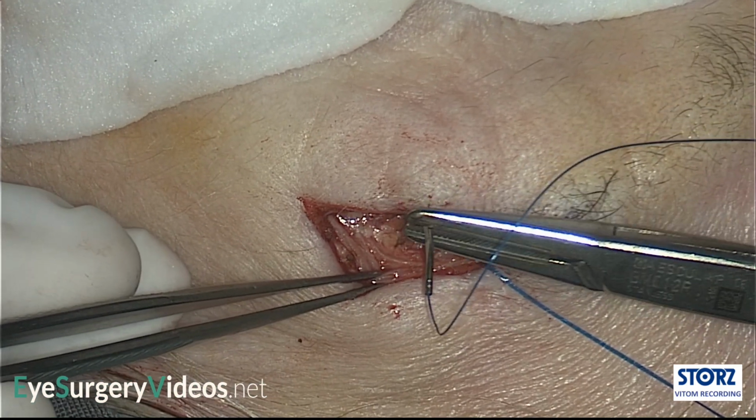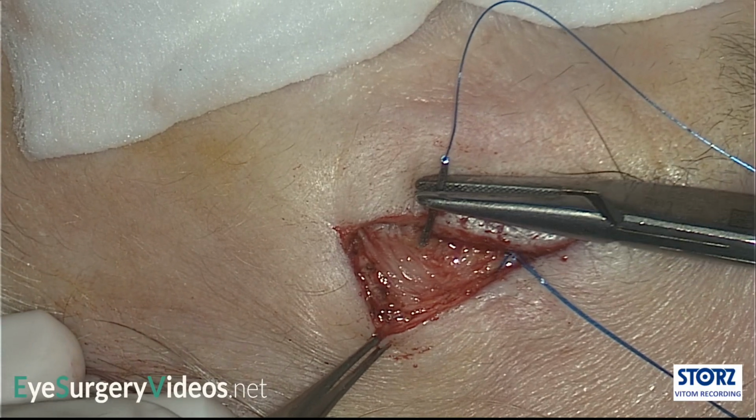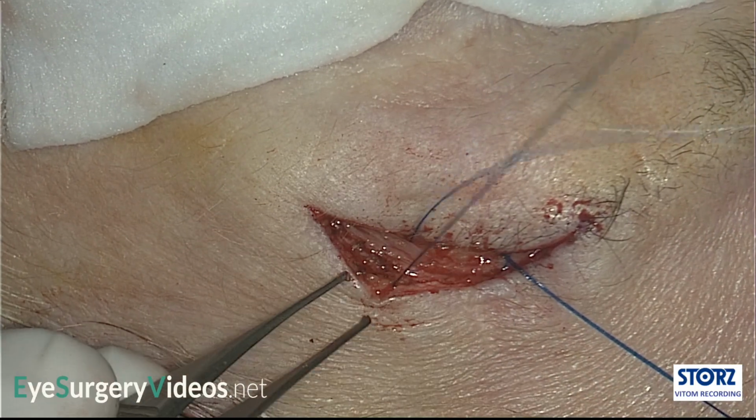Prolene 4-0 sutures are being used in this video, but an absorbable monofilament suture, such as Monocryl, can also be used. Braided sutures such as Vicryl should probably be avoided, as they can slowly extrude postoperatively.